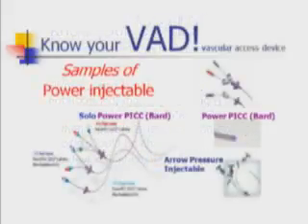Power injectable access devices use unique engineering to allow for injection at a maximum pressure not to exceed 300 pounds per square inch, or PSI. Power injected contrast for stroke code CTs is often injected at a rate of 6 milliliters per second and higher than 300 pounds per square inch. Until we are able to place catheters FDA approved for that rate, power injectable catheters may not be used for stroke code CTs unless the rate is reduced.